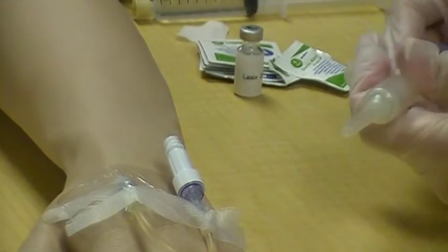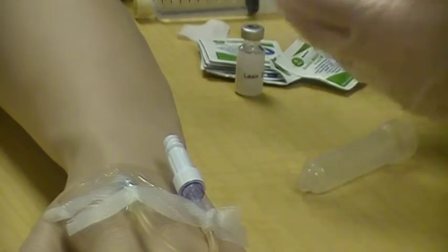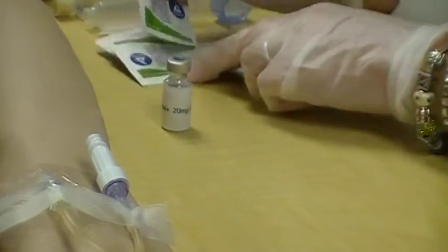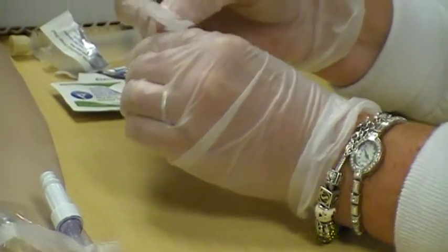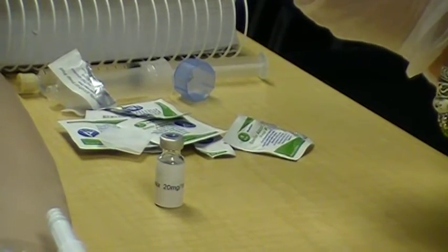The next thing is we're going to pull up our medication. Again, it can be a pre-filled syringe or you may have to pull it up. For our demonstration today, we're going to be giving 20 milligrams, and our vial says that it's 20 milligrams in 1 milliliter. So again, you may have to do some math problems. In this instance, we're going to pull up 1 milliliter.